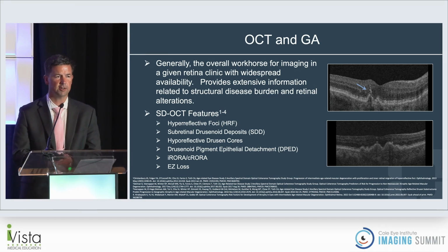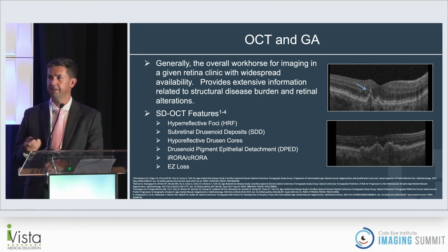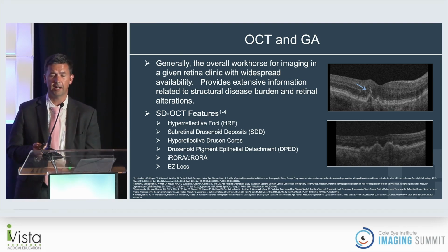What about OCT and geographic atrophy? And I'm going to spend the rest of the time talking about OCT because honestly, for me in managing dry AMD, this is really the only thing that I feel like you really need if you're sure that it's dry AMD and you're not looking for other things like masquerade syndromes that fundus autofluorescence could be really helpful for.